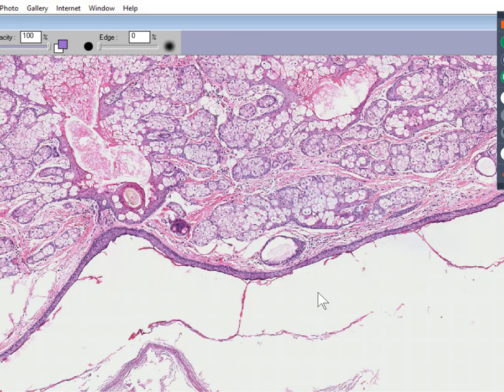So how could hair be inside of an ovary? Well, this is a teratoma. This is technically a germ cell tumor because it's derived from multipotential or totipotential cells, and this particular type of tumor is not only cystic, but it has epithelial and glandular and hair and connective tissue components and blood vessels. So you know it's a teratoma, and it's cystic, and it contains, as you can see, sebaceous glands emptying into these hair follicles, which is right here. So you could probably call this a benign cystic teratoma.